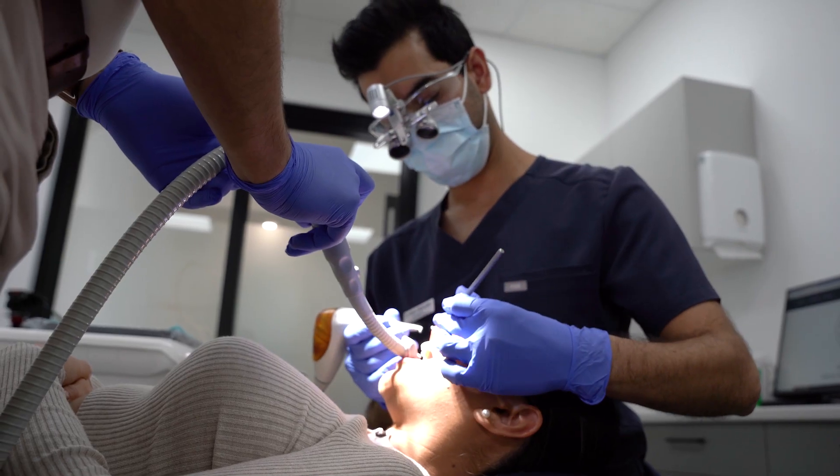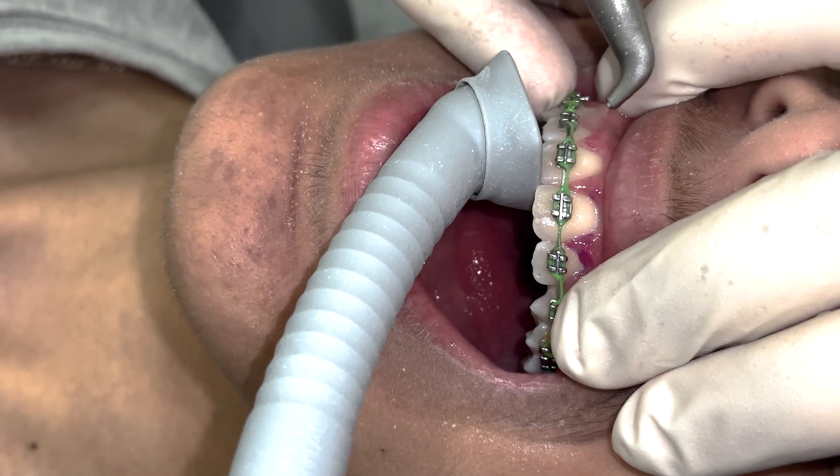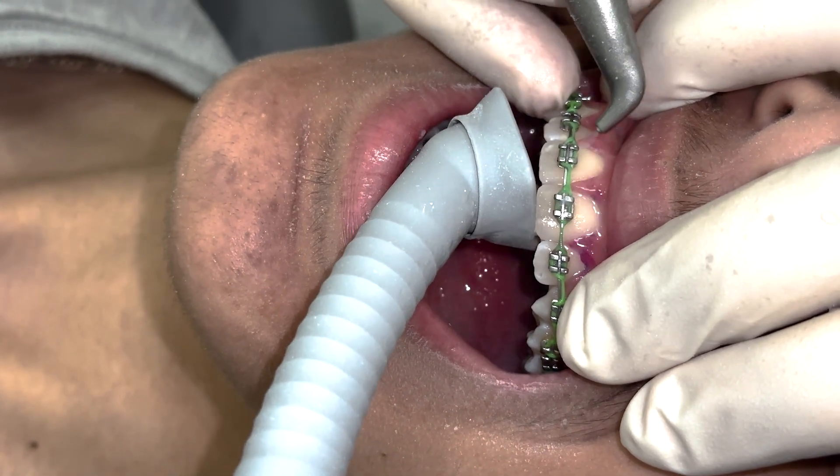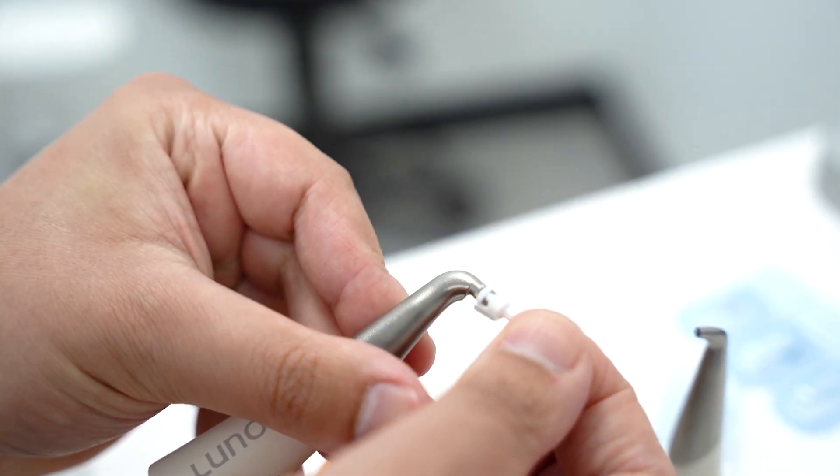These include general recall prophylaxis appointments, cleaning around orthodontic brackets, and preparation before the application of fissure sealants. The Mylinos perio nozzle is used for subgingival treatments including implant maintenance.